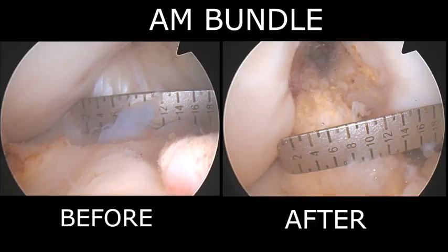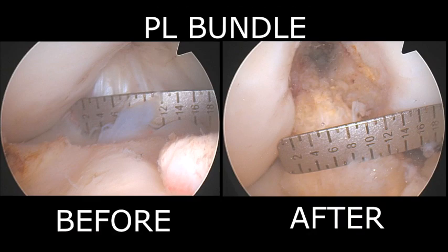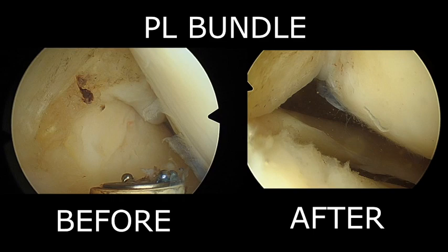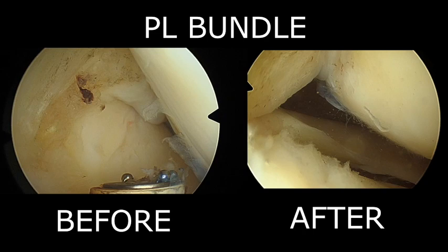You can see before and after decompression of the anterior medial bundle, and you can also visualize the posterior lateral bundle decompression before and after the procedure. We can also decompress the posterior medial and posterior lateral compartments of the knee if there are any changes in the ACL in that area. Thank you for allowing us to present this video.